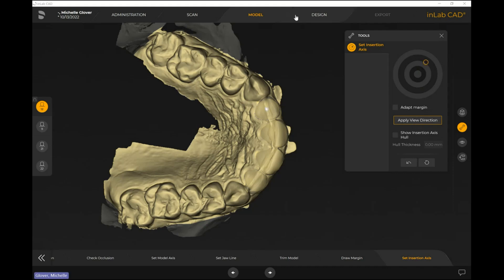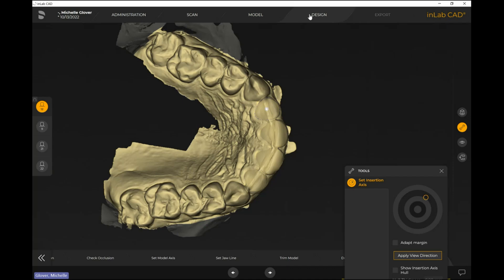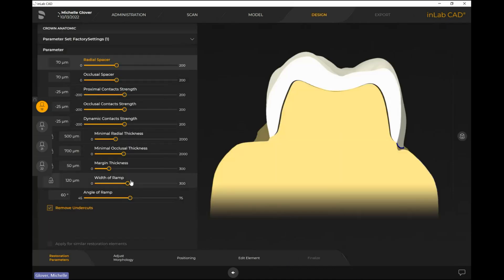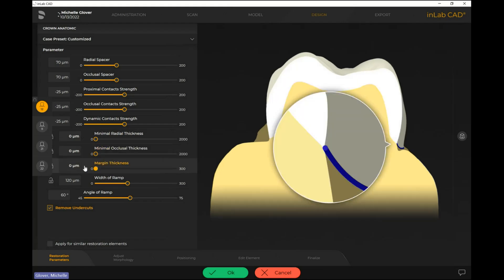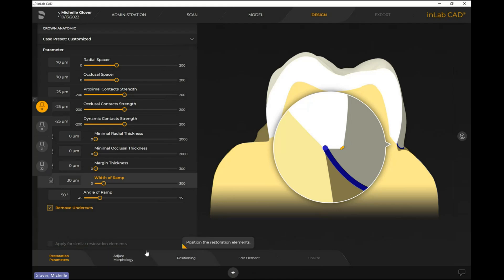Moving forward to the design step — from a parameter perspective, there really isn't a need to worry too much about minimal radial thickness, minimal occlusal thickness, or margin thickness, because we don't have an actual prep here. If you need to bring these things down a little, that's totally okay. Things like proximal contact strength, occlusal contact strength, and dynamic I usually leave as-is, since we want proper contacts considered.